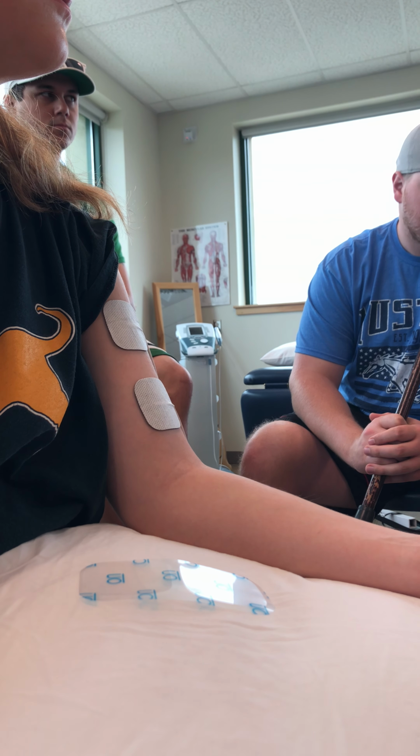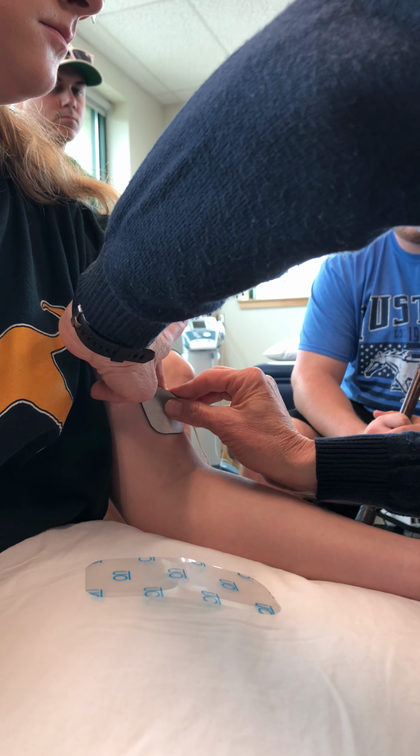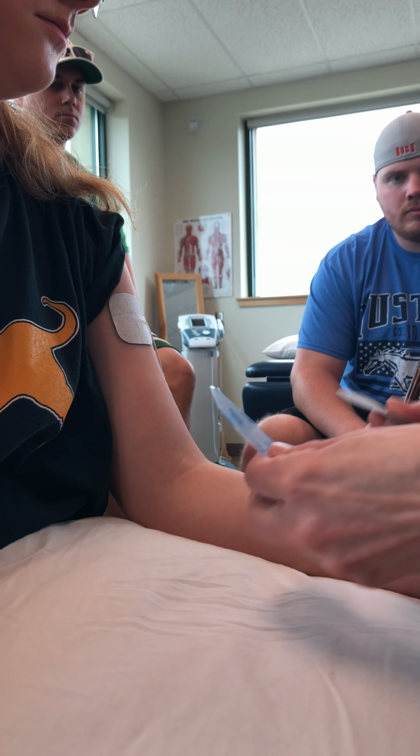When you're done, you just make sure you're careful with the pads, right? Just don't rip them, so you don't rip her skin.